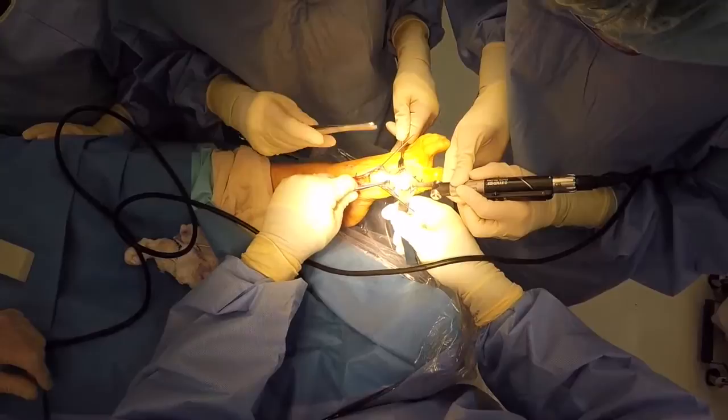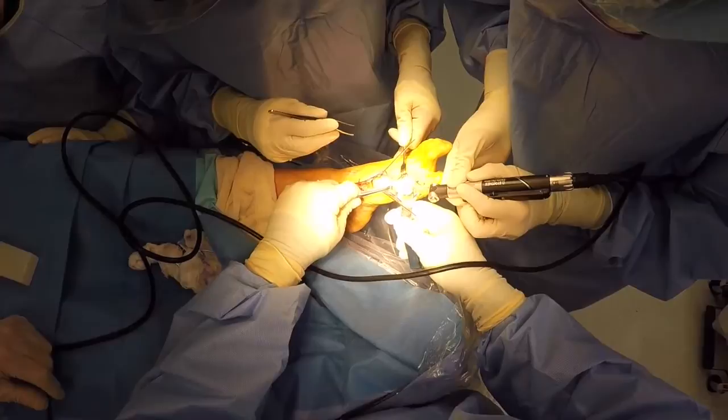Here we are removing the medial eminence, taking great care to preserve the plantar sagittal groove and not stake the head.